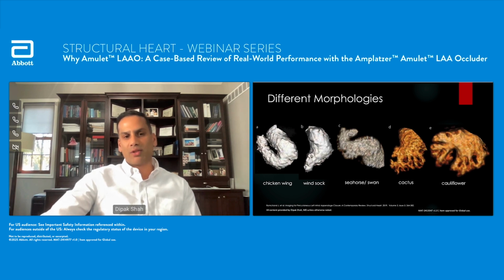They give us more opportunity to close all kinds of structures. When you look at these structures here, again, just five common ones: chicken wing, windsock, seahorse/swan, cactus, cauliflower.